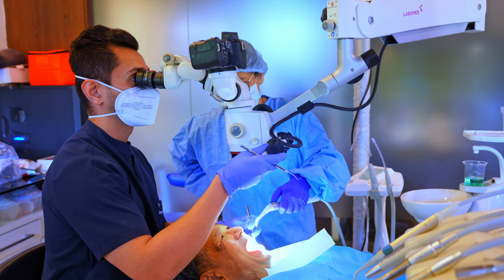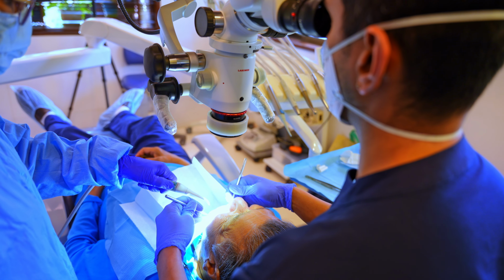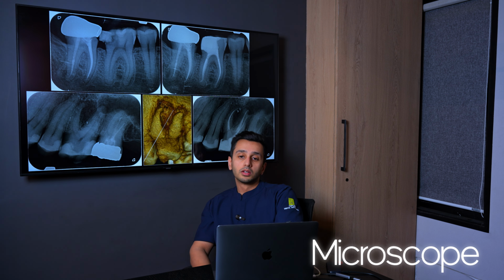One of the people who's part of the team and part of this whole setup for the recording was quite mesmerized an hour ago when I was working on a patient, and asked me what that big thing was that I was looking down into while working on a patient. So that, my friend, is a microscope. A microscope is a device which is used for magnification, for better accuracy and optimization of treatment as well. And that's what we have here in Opus. It's not only for root canal treatments.